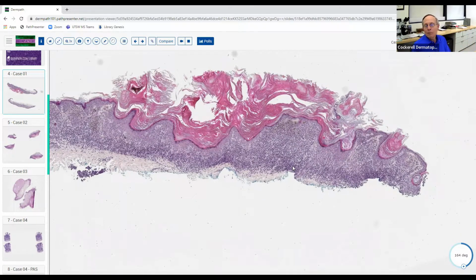And you may have a few residual melanocytes in the epidermis, or you may not have very many, but overall it has the architecture of something broad and not well circumscribed. So halo nevi are like nevi: small, well circumscribed, symmetrical, all those kinds of things. They just have a dense inflammatory infiltrate in them.